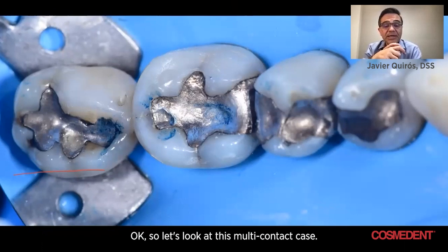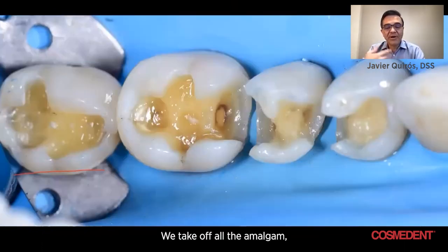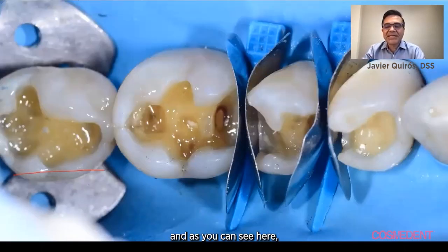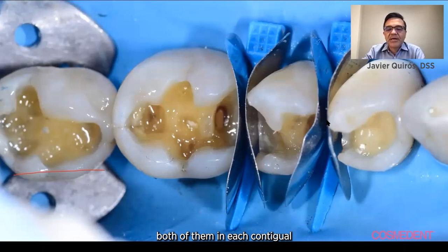So let's look at this multi-contact case. We take off all the amalgam, we isolate with a rubber dam, and as you can see here, we place our cosmeted sectional matrix, both of them, in each contiguous contact box.